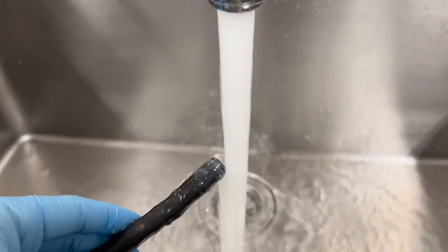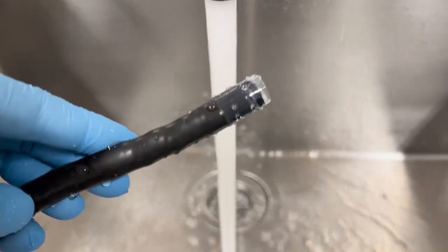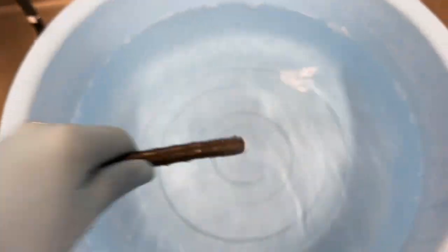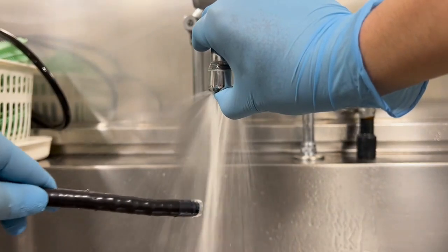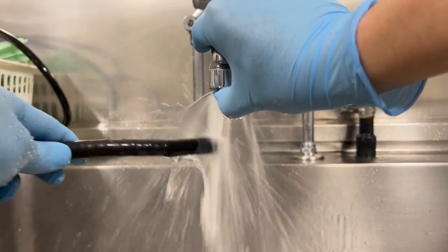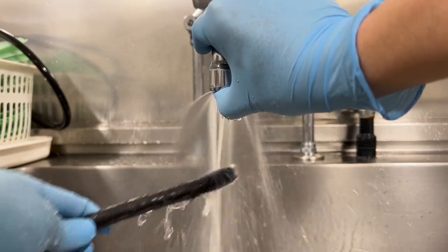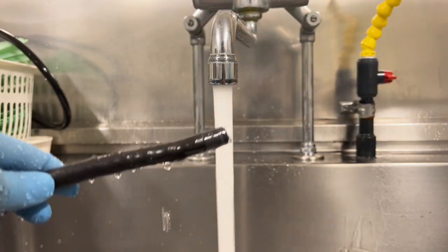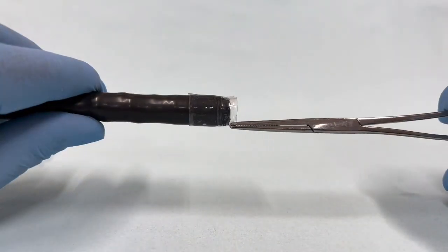We evaluated the durability of this tape in vitro. The tape hood did not fall off when exposed to water from the top, when submerged in water, or when subjected to strong water current, or pressure with a pen.